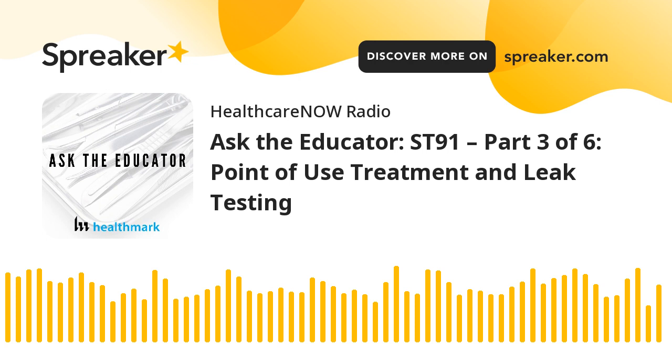The other thing that is reinforcing the way scopes should be transported are the manufacturers. I mean, you're going to damage the scope if you don't transport it in the right way. Carrying it in your hands is not appropriate either direction, soiled or clean. And again, making sure the coiling is appropriate, but it's not just OSHA, it's the manufacturers that drive this too. Thanks, Adam, for letting me fit that in. Oh, yeah, no problem. Absolutely.